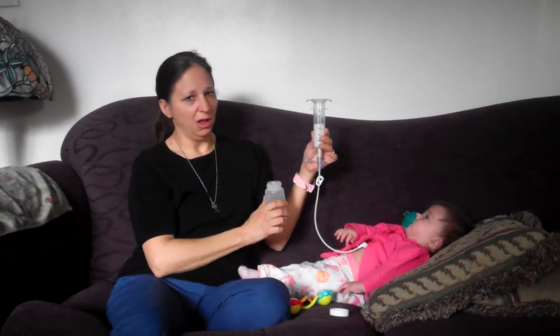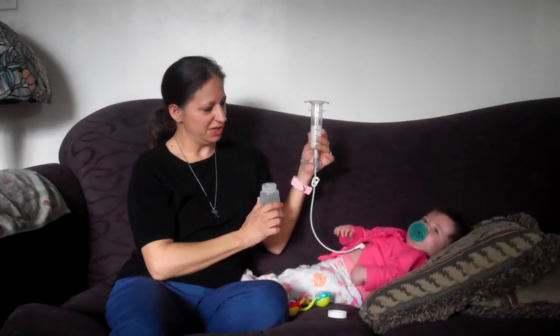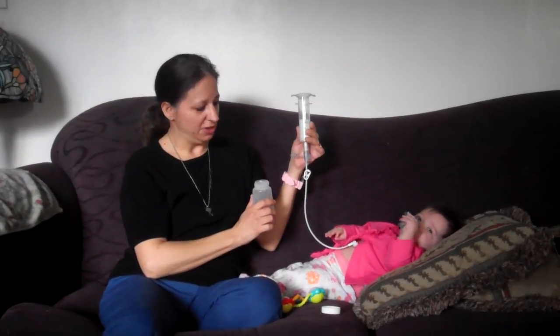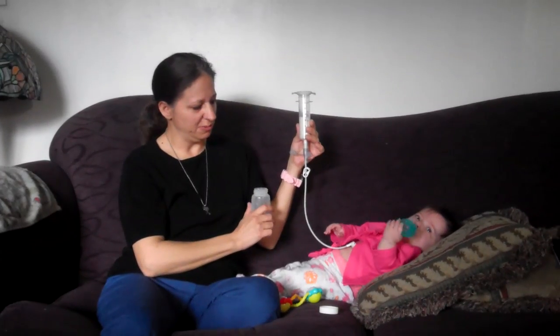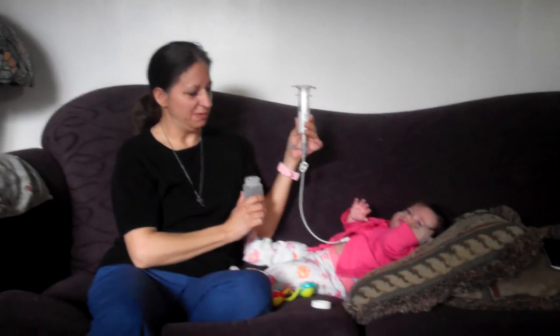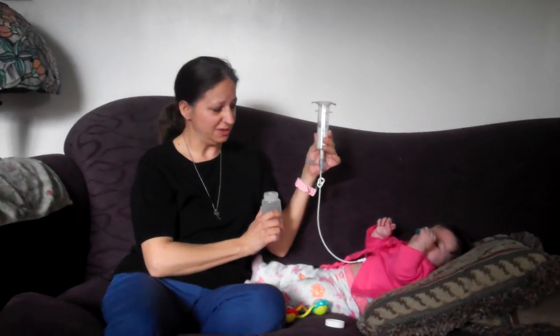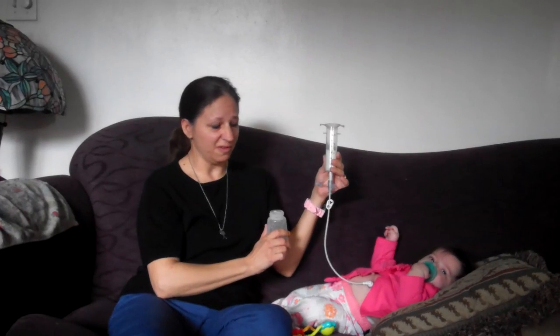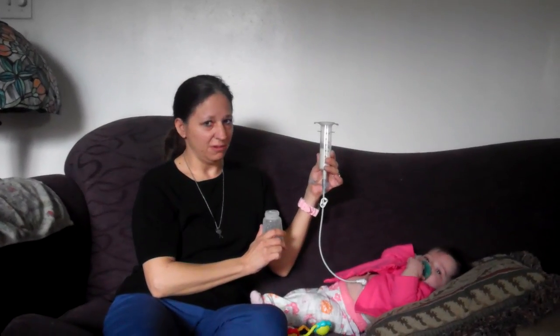But we're trying to get all her feedings in during the day because she is getting older and kind of getting all over the bed, and we don't like that tube hanging in her bed from the machine. But it's not that hard. We were intimidated at first. It took us about 2 weeks to use it. I could make another video showing you if anyone's interested, but it really isn't that hard at all.